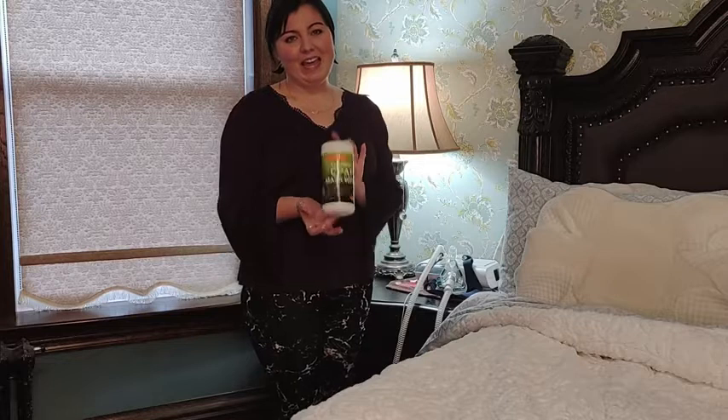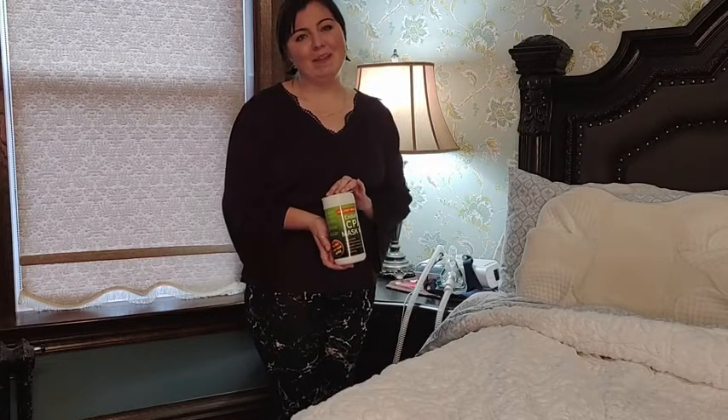Hey there! It's Phil from WTI, and these are my CPAP mask cleaning wipes from EnduraMed.